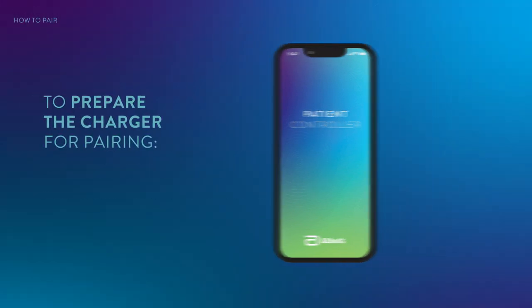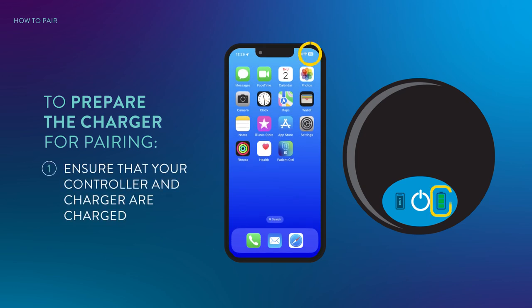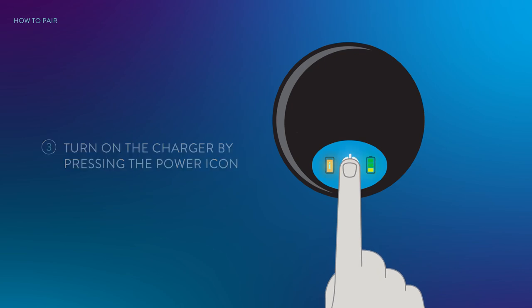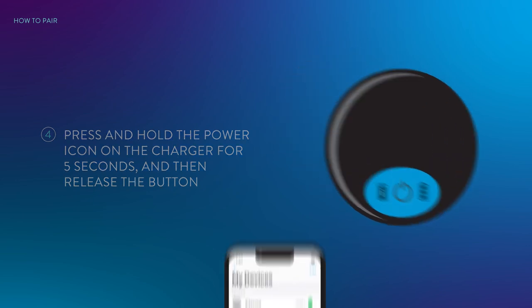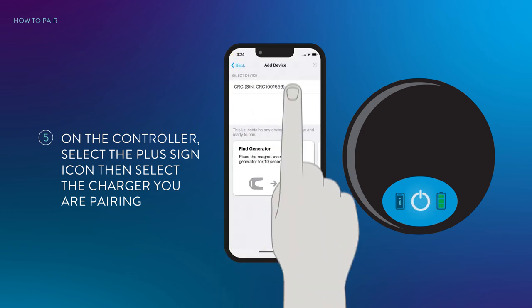To prepare the charger for pairing, ensure that your controller and charger are charged. Open the patient controller app and place it near the charger. Turn on the charger by pressing the power icon. Press and hold the power icon on the charger for 5 seconds, then release. The power icon and the battery icon will blink once, then the power icon will blink quickly, indicating the charger is in the pairing state. On the controller, select the plus sign icon, then select the charger you are pairing.